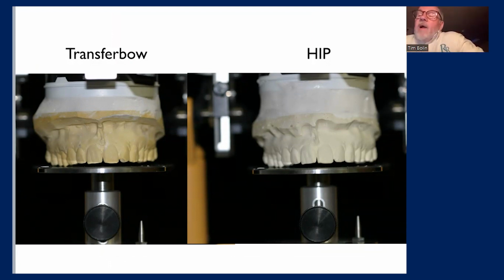The HIP mounting took very, very little time to get this on an articulator. Transfer bow took a little bit more. HIP is a great way to go.